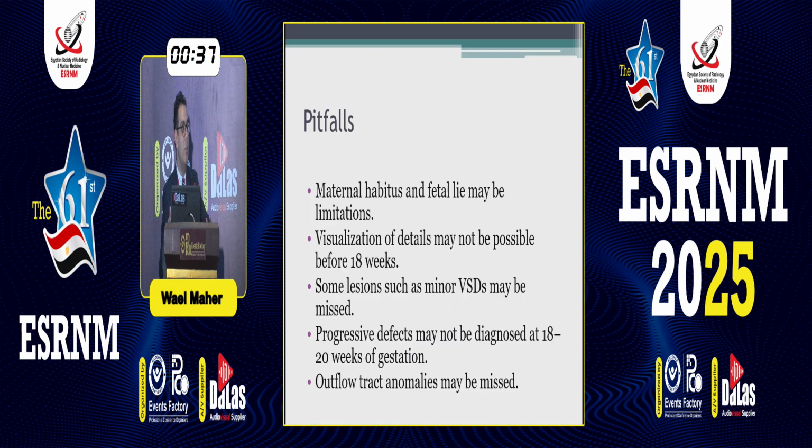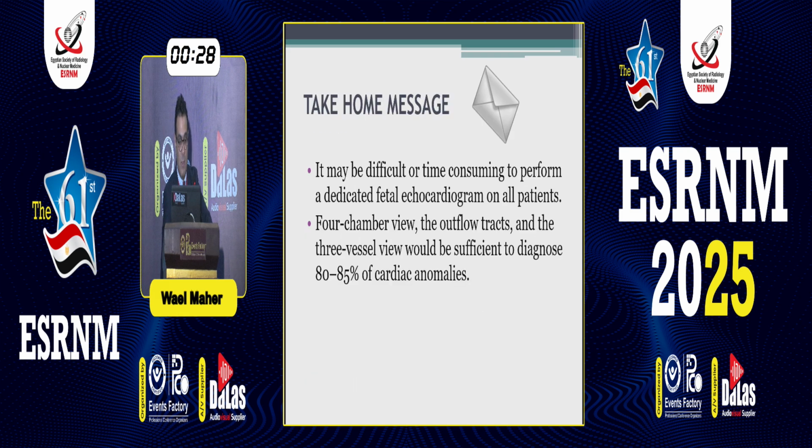The pitfalls: the maternal habitus, obesity can compromise the image. If we have early gestation and we need to check the heart, that also can compromise the image. And the outflow tracts might be missed, so it needs practice.